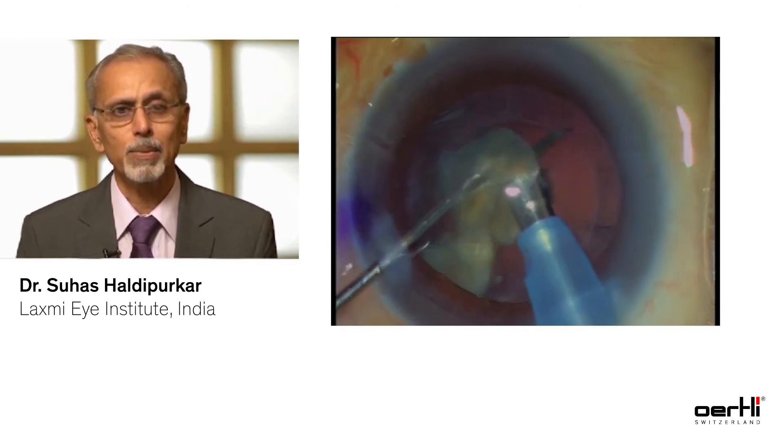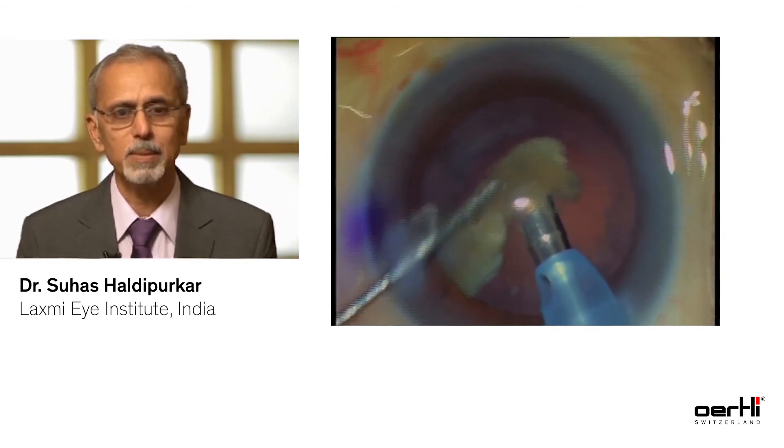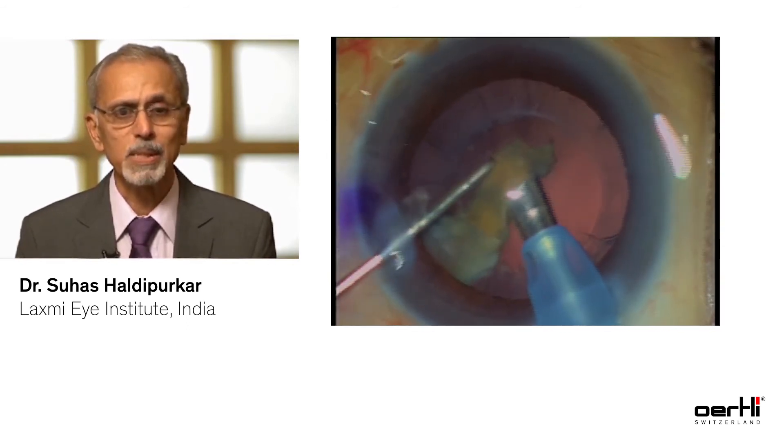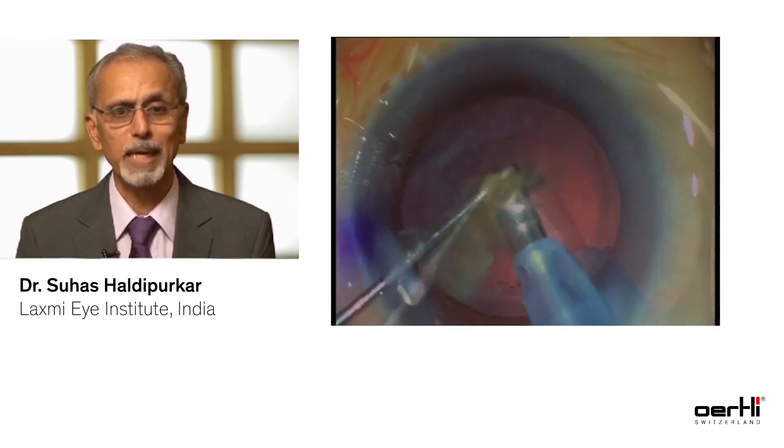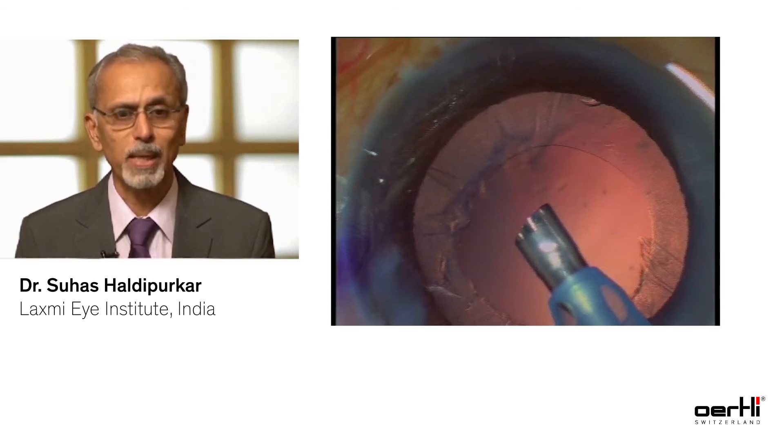When I have the last couple of fragments to be emulsified, I would lower my vacuum to around 350 and my flow rate to around 35 cc. This is a crucial stage where you have only the last two fragments. Notice the kind of stability that the Easy Tip offers in this case. In conclusion, Easy Tip and Easy Faco technology has really brought phaco to a newer level — it has made it more standardized, easier, and much safer for hard cataracts.